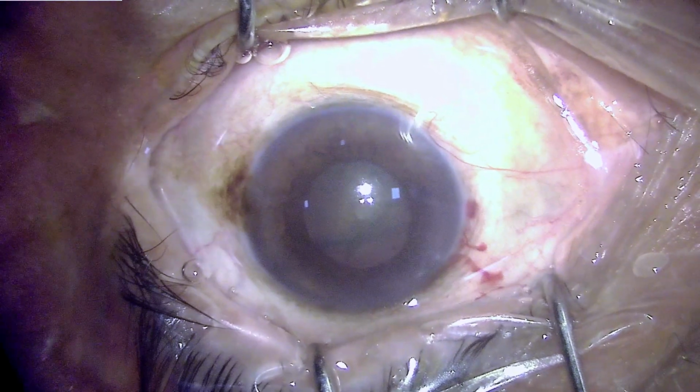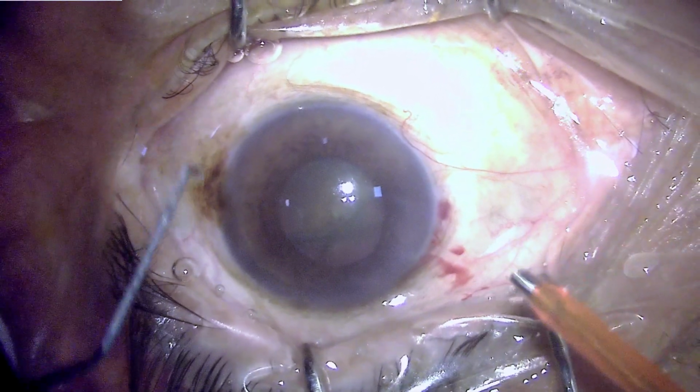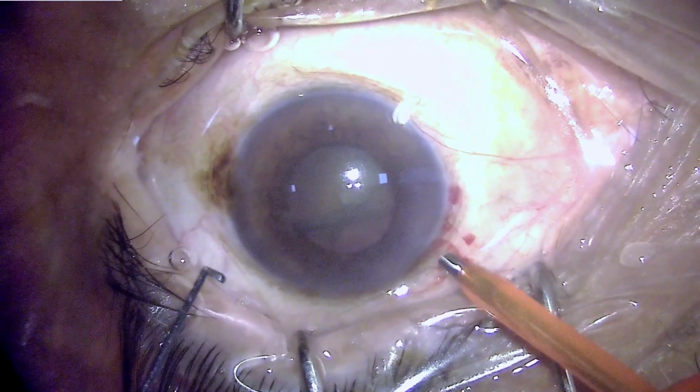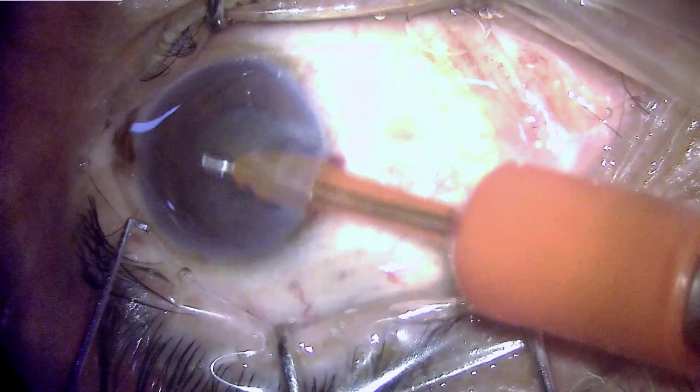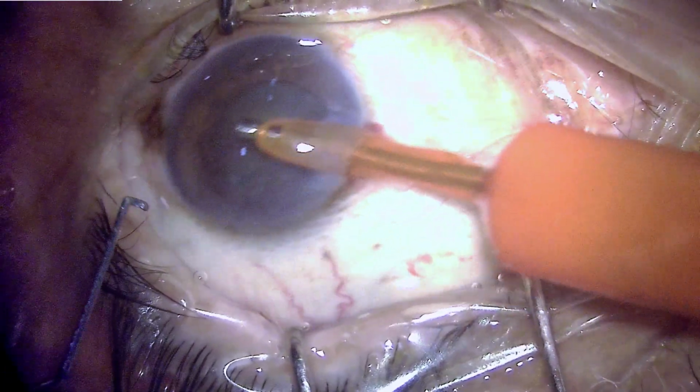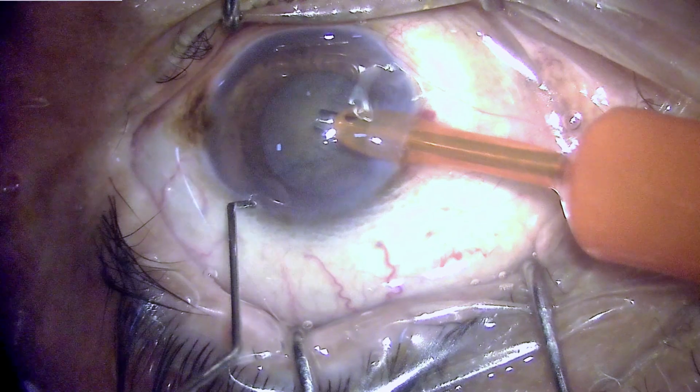Proceeding on to phacoemulsification once the hydrodissection has been completed, and this is a mini flare tip which I suppose provides me with better holding and more focused ultrasound energy delivery.